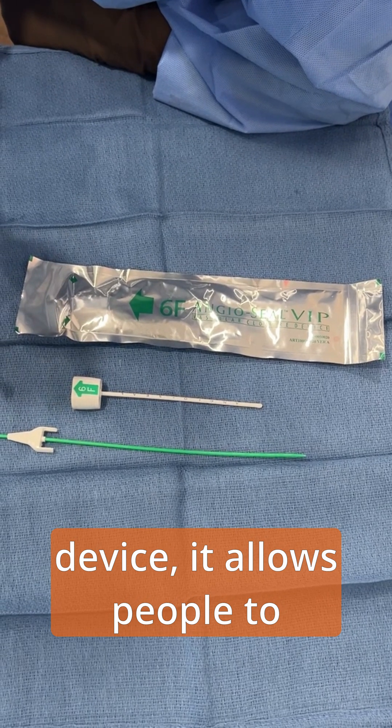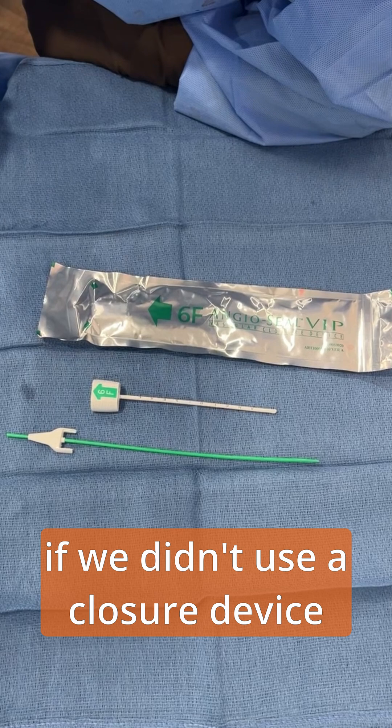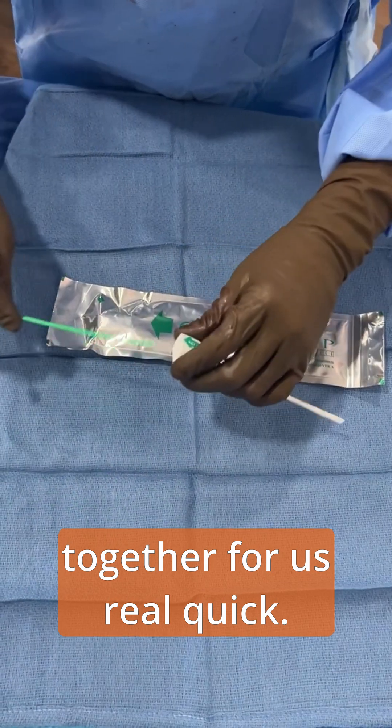It allows people to ambulate much faster than if we didn't use a closure device, and it allows us to do things in the outpatient space. So I'm going to put it together for us real quick.